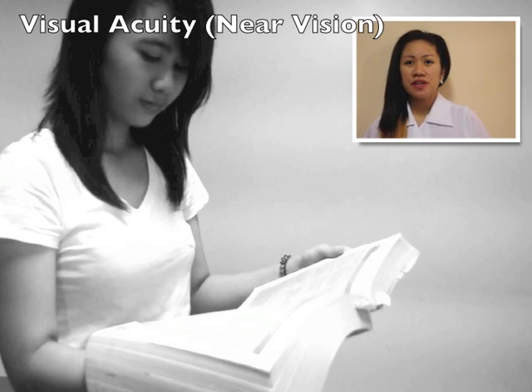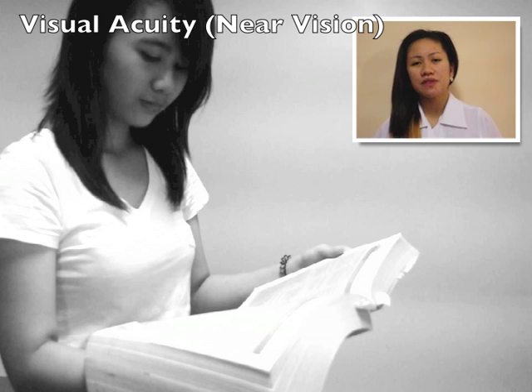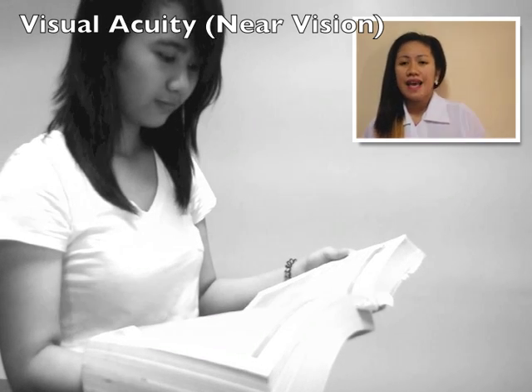Have the patient hold the near screen about 14 inches away and read. And next, let the patient read the near screen easily at a distance of 14 inches.